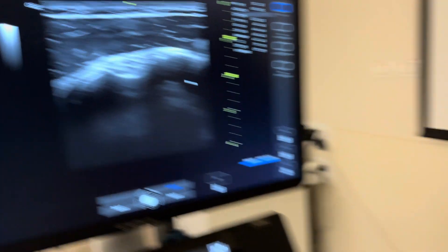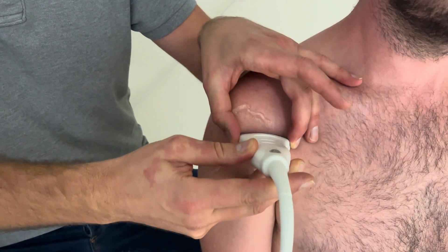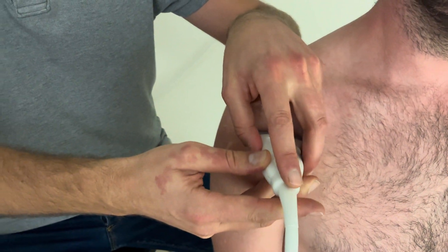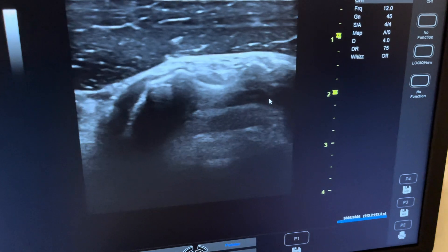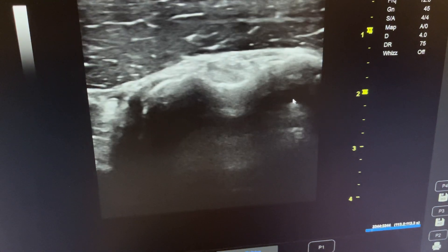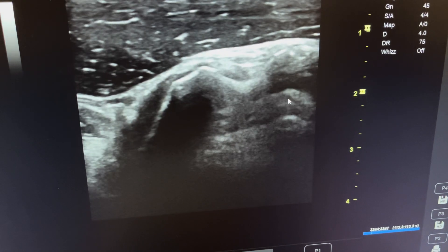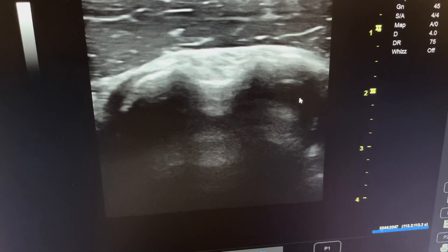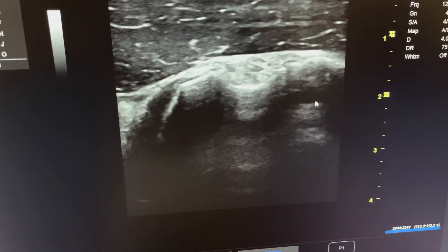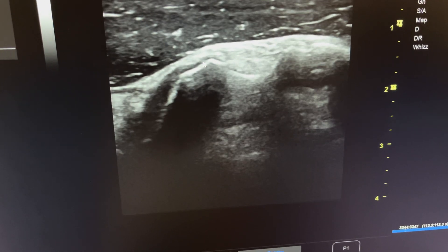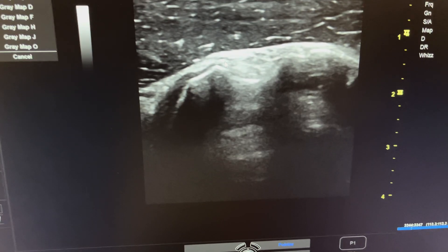If you watch my probe now, I'm going to make a tilting movement — angling it this way and that — to introduce anisotropy inside the tendon. Sometimes it's difficult to identify exactly what is the tendon, so I make this angle change and you can see the tendon becomes completely filled with anisotropy.